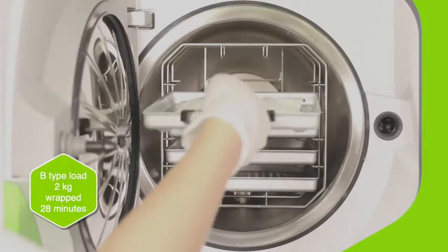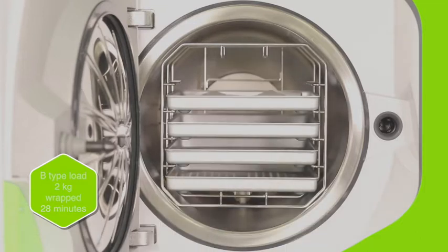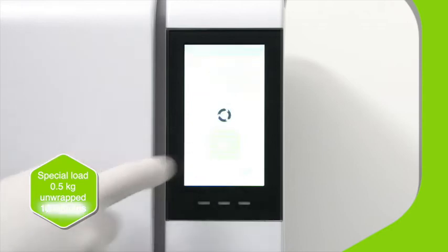An average dental load is processed in as little as 28 minutes, and that includes drying. Lisa also has a fast cycle, which can be processed in as little as 13 minutes.